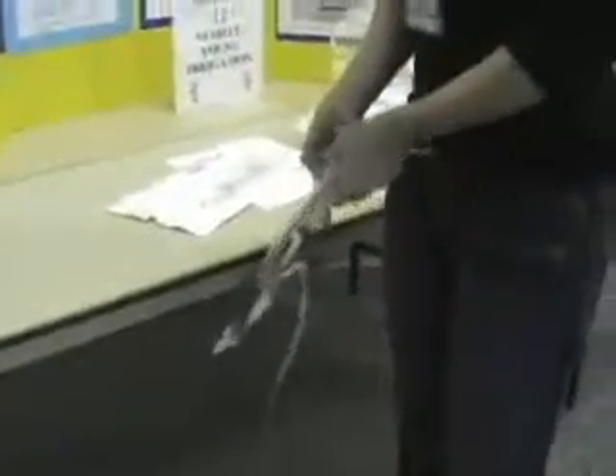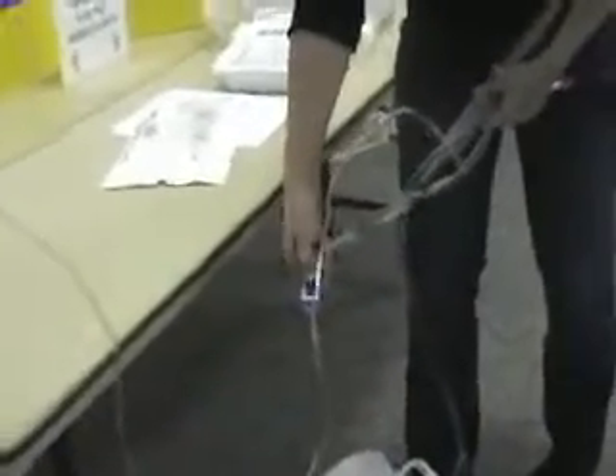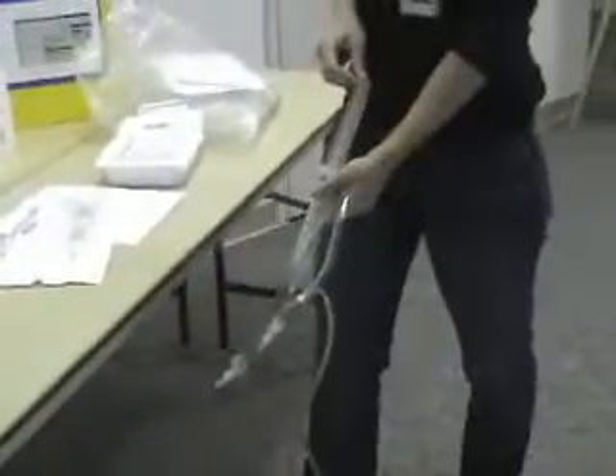So I'm going to clamp it, then I'm going to open up the irrigation and draw usually 100 to 150 cc of normal saline by pulling on the syringe. That's pulling the saline into the syringe, and a little bit is actually going into the bladder at the same time. Then you're going to clamp your irrigation, and when you're done, you're going to start irrigating the bladder. It creates a whirl system inside the bladder that gets all the stuff stuck to the bladder — the clots — and basically removes it.